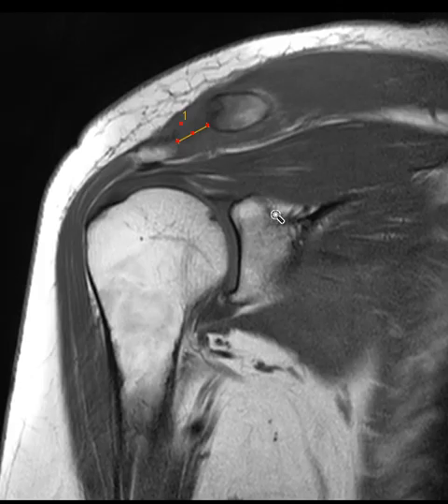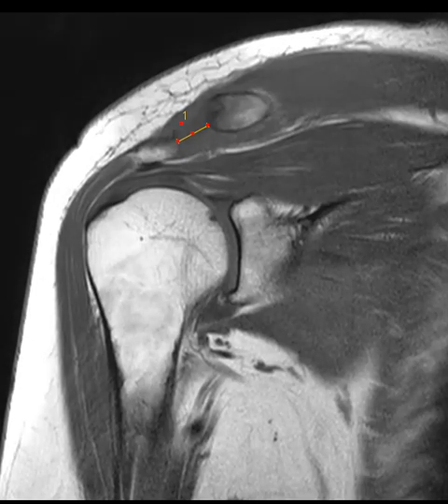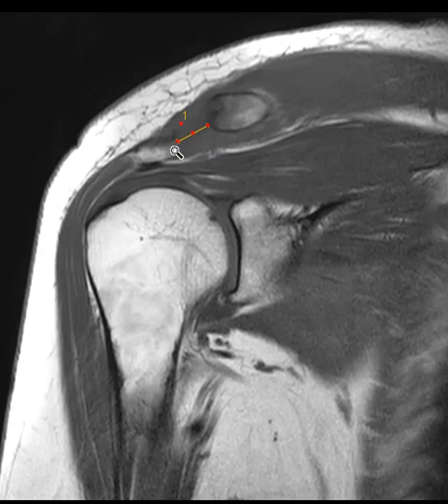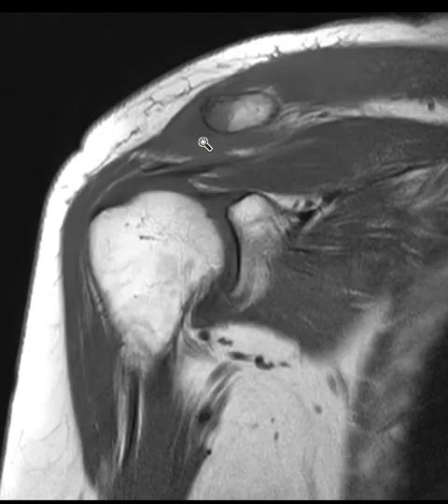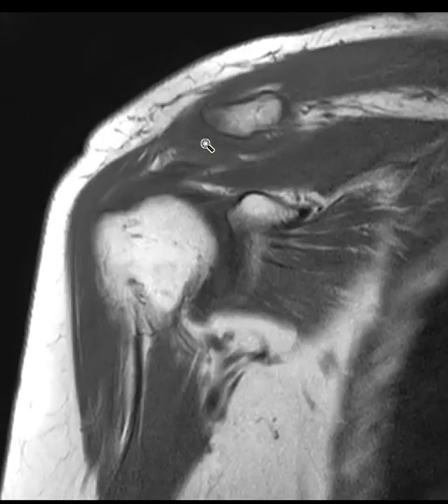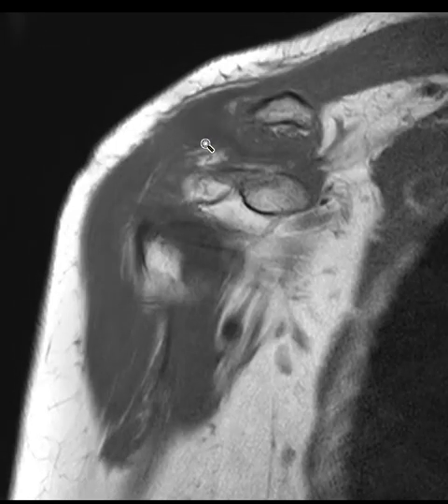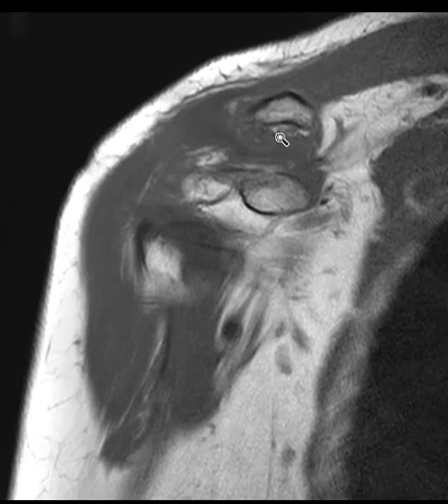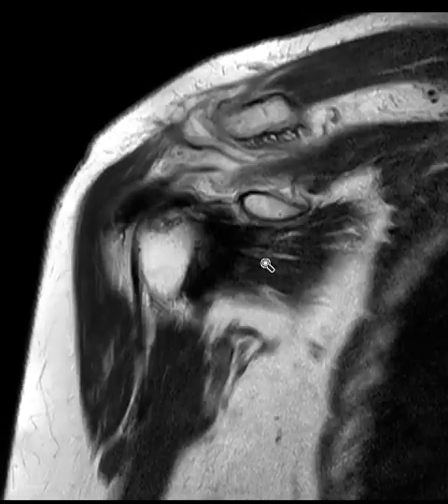This is another view where fluid is dark. We can see the end of the clavicle better here, and the acromion process, and the distance is way too wide again — over a centimeter, when it should be less than five millimeters. Coming over to this other view, we see the coracoid process and clavicle, and again this distance is very wide and that ligament complex is completely torn.